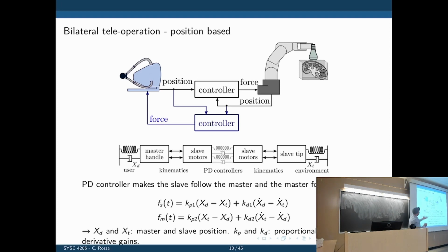Right? So if I move the handle of the haptic device, the robot will move accordingly. If I move the robot, the haptic device follows accordingly. So the notion of a master and slave in this teleoperation network doesn't exist anymore because they should operate in the exact same way. So the idea here is that if we now move the haptic device and the robot encounters an obstacle, it will no longer move. So that generates a discrepancy, an error between the desired and actual position, which is now felt by the user in the form of a force.